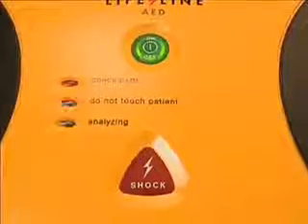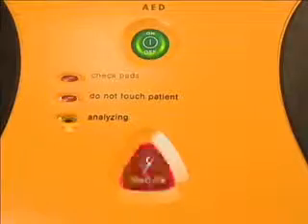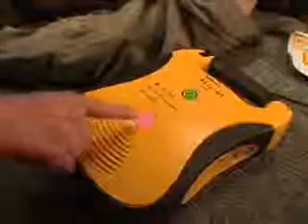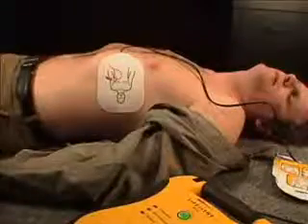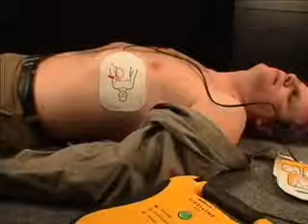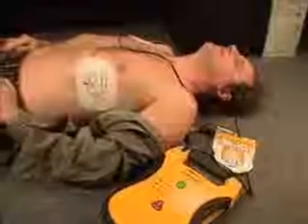If a shock is required, once the AED has fully charged, the shock button will flash and the AED will instruct you to press the shock button. Press the shock button to deliver a shock. Press flashing shock button. Shock 1 delivered. It is safe to touch the patient. Begin CPR now. No shock advised. The Lifeline AED will not shock a victim that does not require a shock.